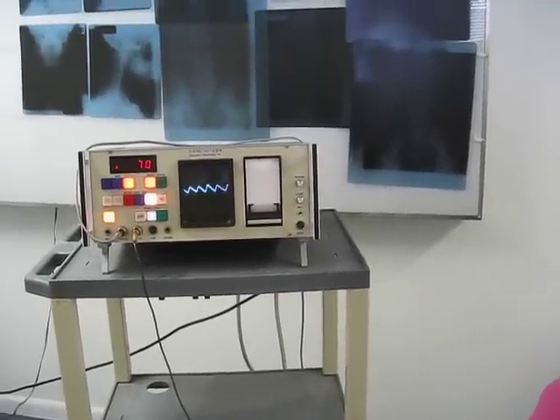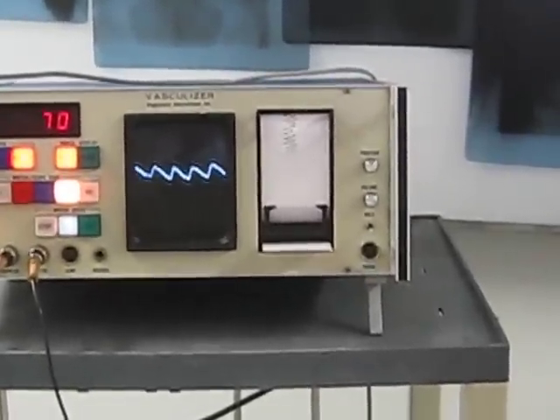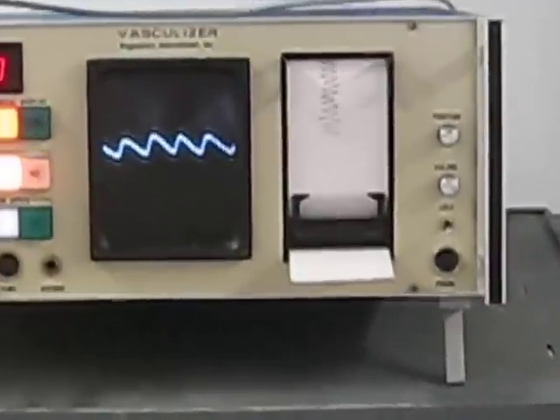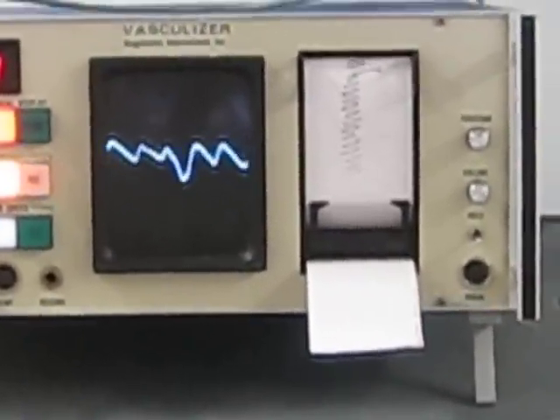This is a 29 year old patient in which we're doing a thoracic outlet study. This is going to be on the left side of her hand. We're establishing a baseline in position number one as you can see. The wave is normal and the amplitude looks fine.